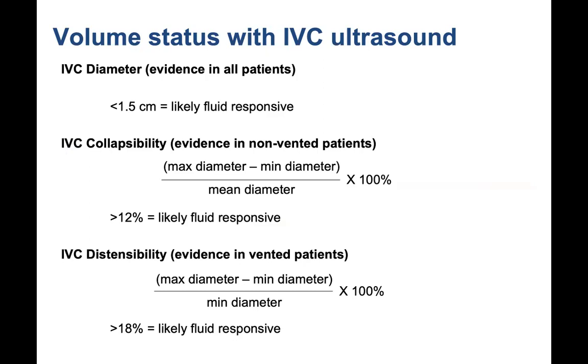IVC distensibility is in our ventilated patients. It's just a slightly different equation. Instead of the mean diameter here in the denominator, we have the minimum diameter. And then greater than 18 is going to be likely fluid responsive.